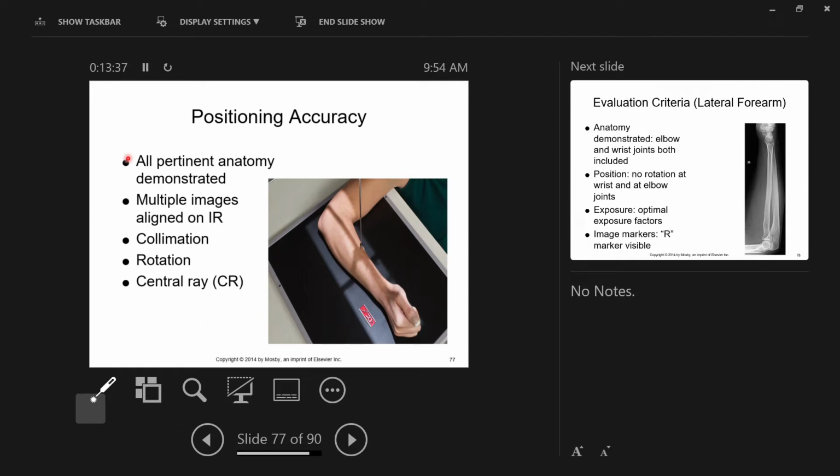What bony anatomy matters for the forearm? What is the forearm mostly made of, Francisco? I just said them if that helps. Radius, right? So show the entirety of both of those bones, okay?